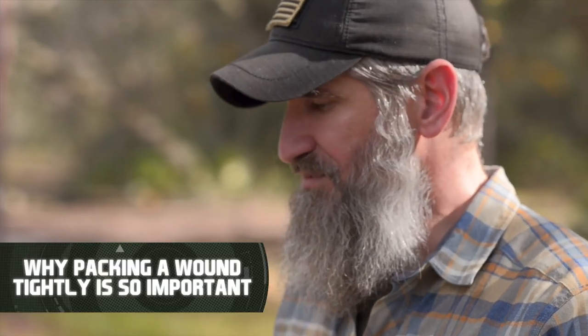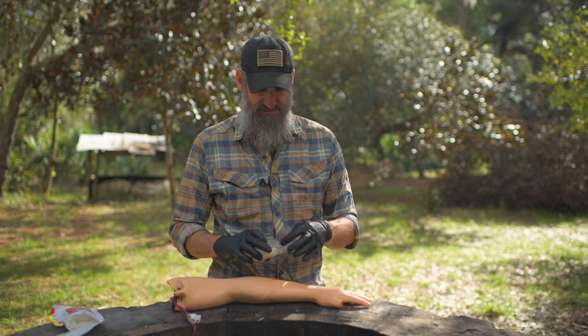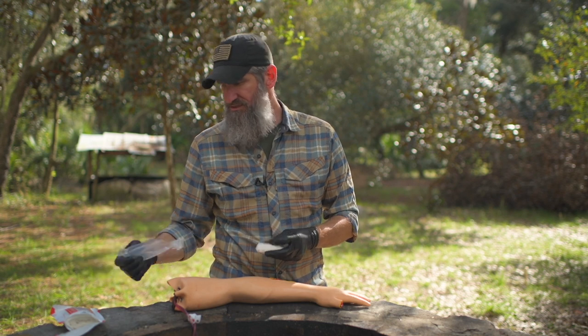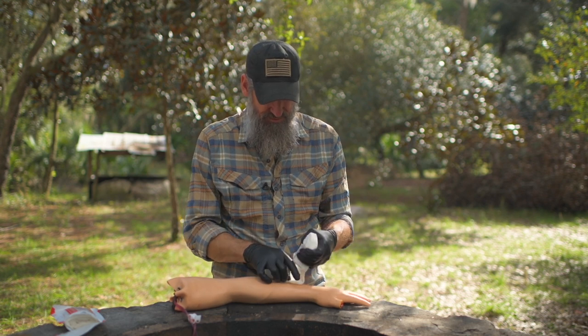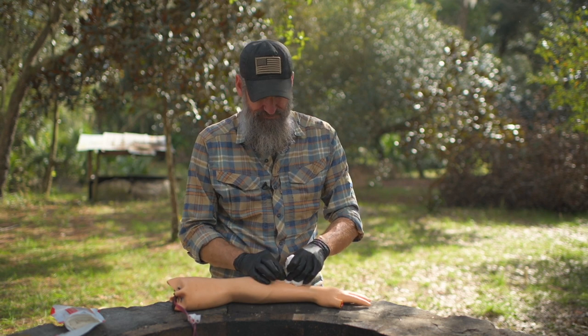So if you don't have any type of hemostatic agent, that's fine. You can use regular gauze to pack a wound. In this case, I'm just using some compressed gauze, but the same principle applies. It just doesn't have that clotting agent that makes it clot faster. But you still want to pack that wound cavity as tightly as possible and get that gauze material down against the ruptured vessel.